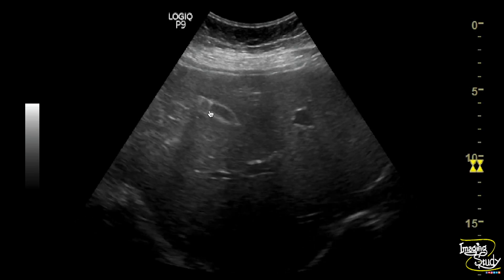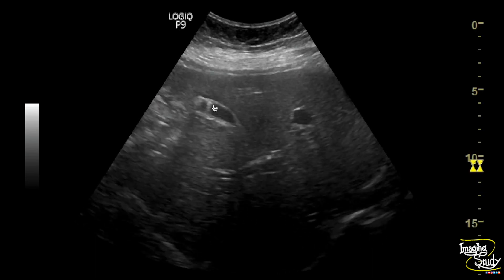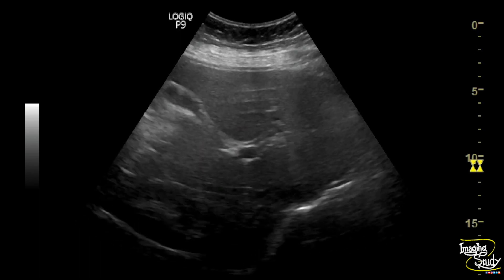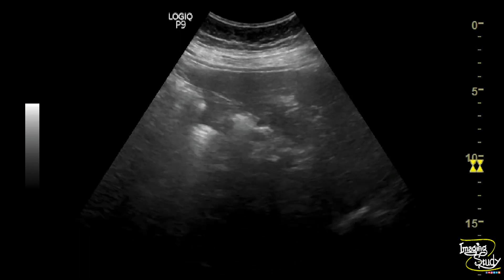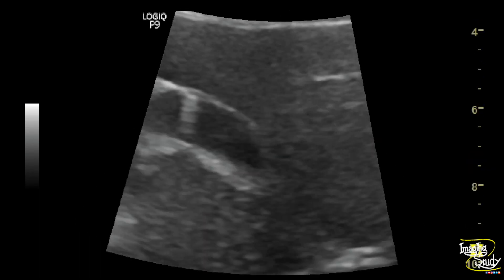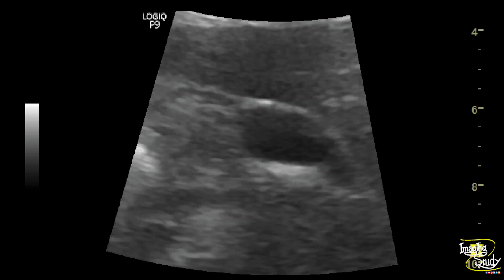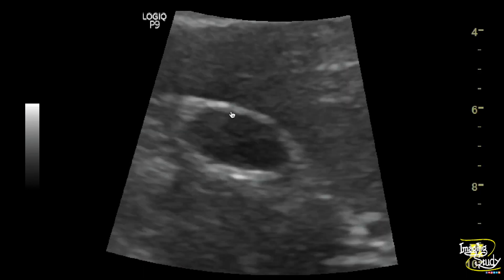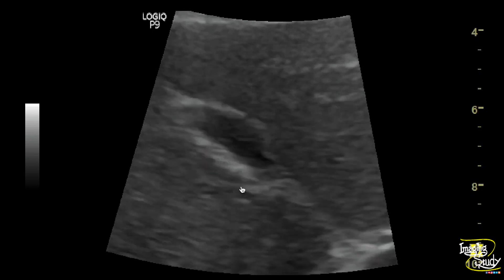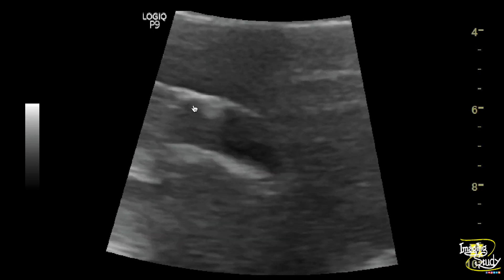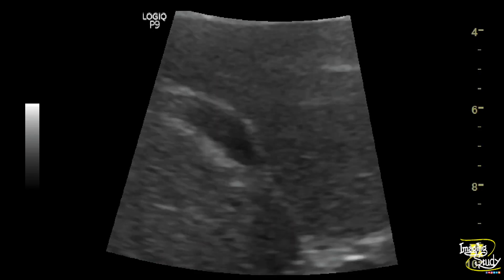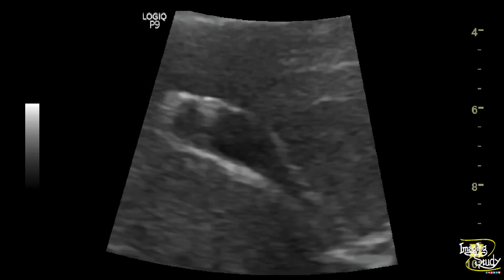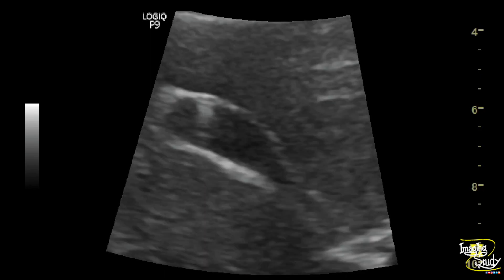If you look at the anterior wall, you can see some comet tail artifacts. Now if you magnify the image, you can get good detail. Here you can see the focal wall thickening with intramural hyperechoic foci casting comet tail artifacts. This focal wall thickening with comet tail artifacts is a feature of adenomyomatosis of the gallbladder.